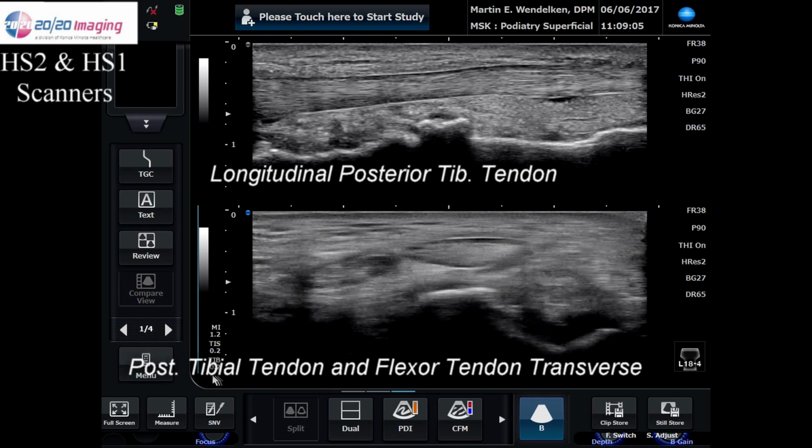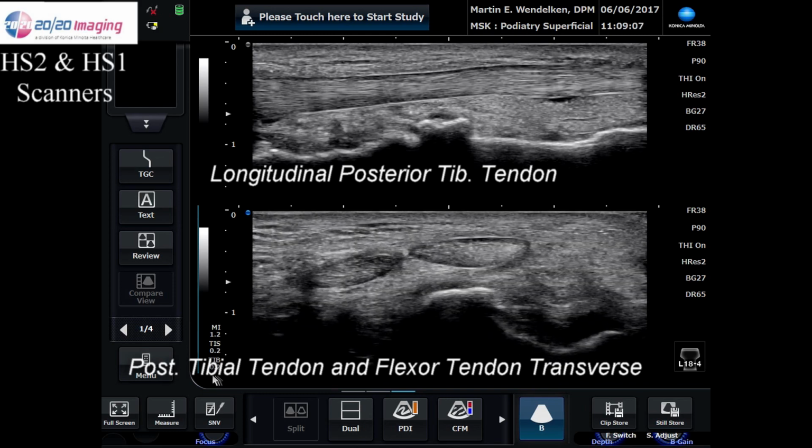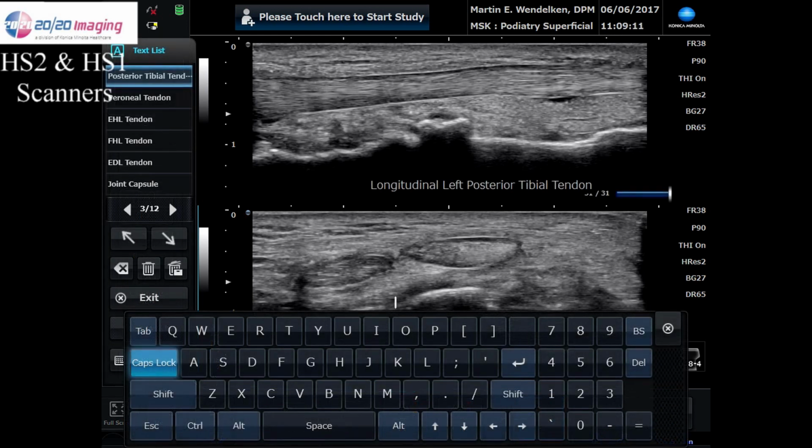Again, labeling is really quite easy. If you really look at the image here, look how clear you can see the tendons. Of course, you could see the tendons in the transverse. You could tell if there's any tears or partial tears of the tendon.